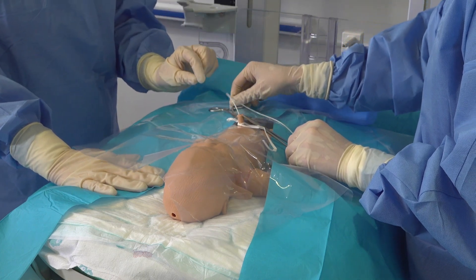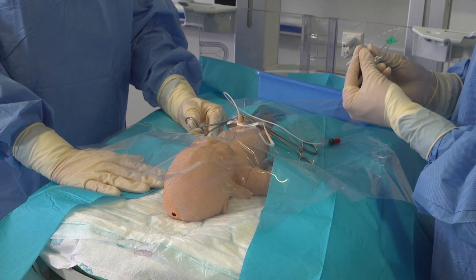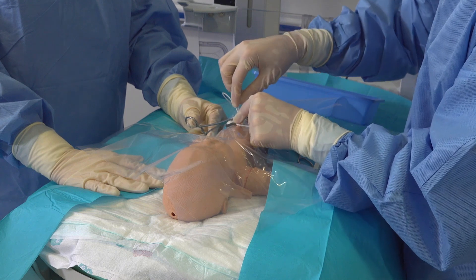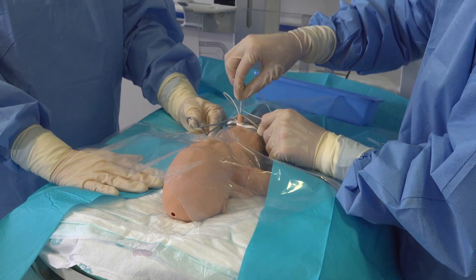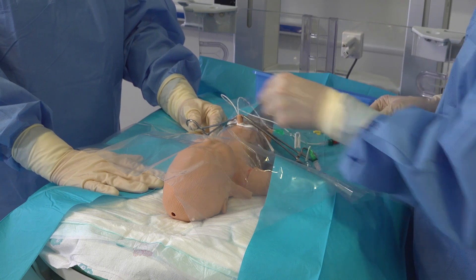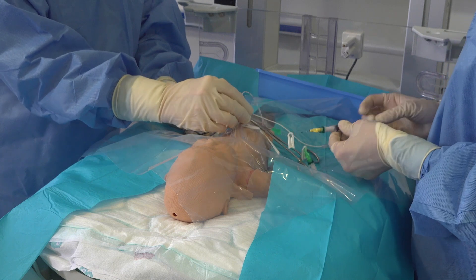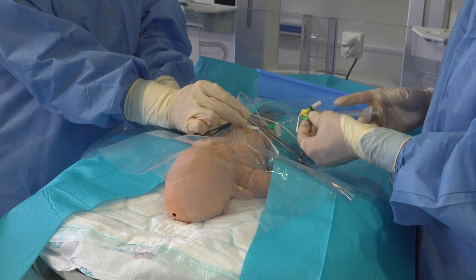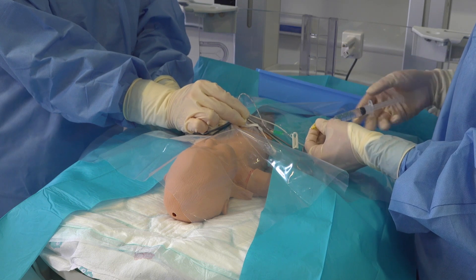Can I ask you just to hold those in position to make sure that the UAC doesn't move while we get our UVC. We're now going to insert our umbilical venous catheter. We've already identified the correct position for it to be inserted as discussed previously, and it generally is a little easier to pass as the vein isn't as constricted as the artery. Once it is inserted to your correct length, aspirate from each lumen of your UVC. Again, as this is a dummy we're unable to show blood being aspirated today, but once you've confirmed that blood is obtained from each lumen then flush both lines again.